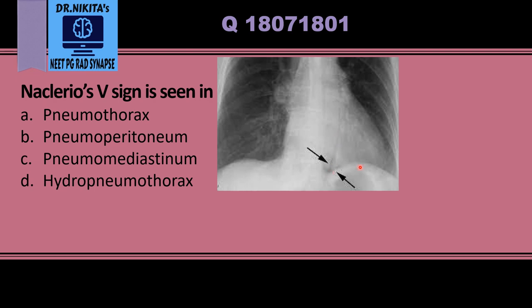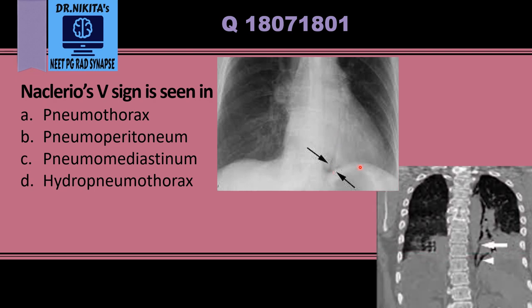If we look at the CT scan, we can see a V-shaped collection. This is the descending aorta, and adjacent to it we see air surrounding the aorta, which means pneumomediastinum. One limb of the V is formed by air adjacent to the descending aorta, and the other limb is formed by air surrounding the medial part of the diaphragm.